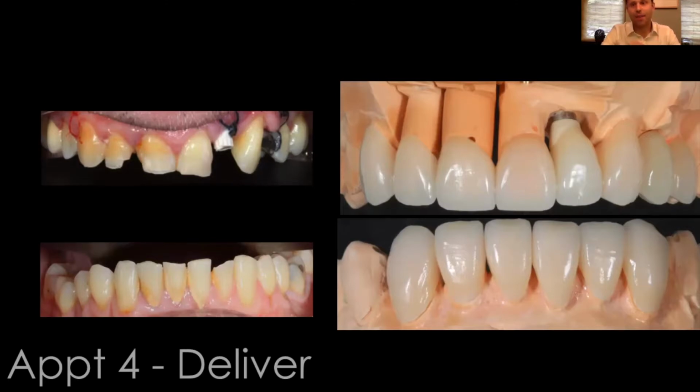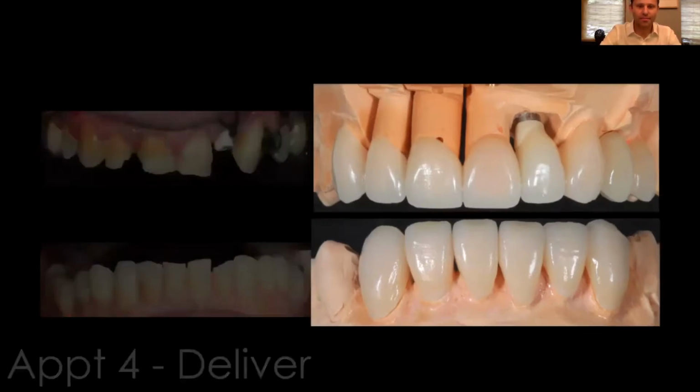And that's actually not a temporary crown, it's a monolithic zirconium coping with PFZ over it, so temporarily cemented. So it's a final restoration, but here we used it as a temporary solution, because I don't want to have a patient break the temporaries. I know it's going to be there for at least 3 to 6 months, so I don't want the temporaries, the discoloration. The key is to get the patients as pleased as they can right from the beginning.